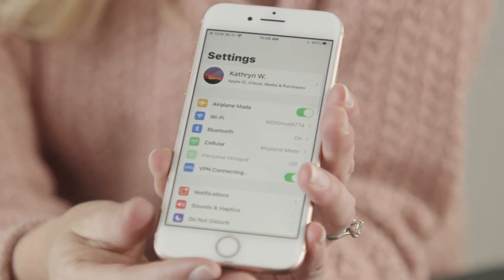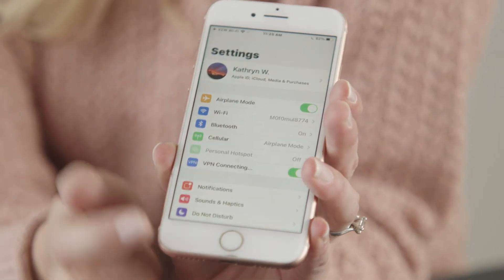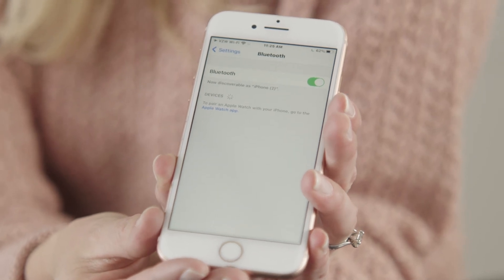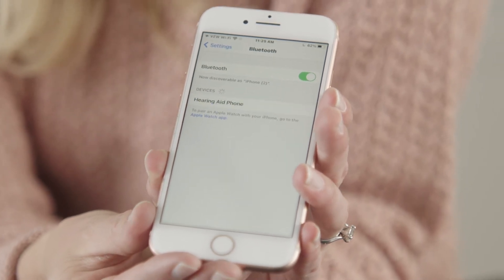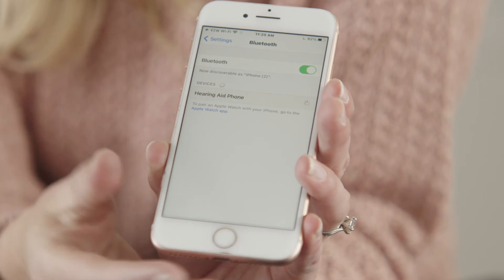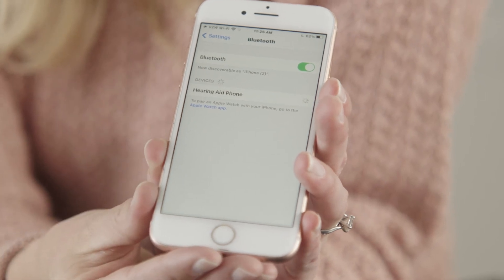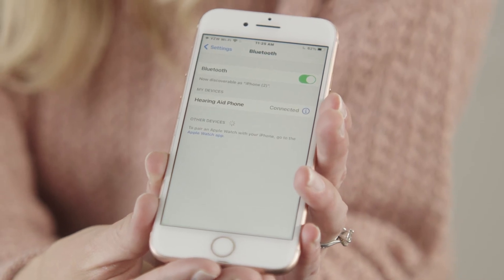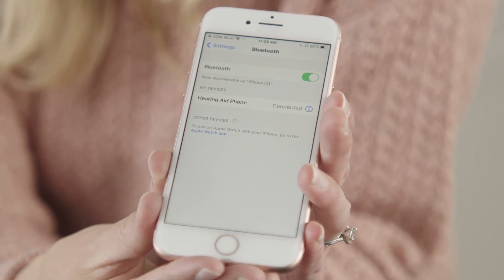Then, tap the settings icon on your phone, then tap Bluetooth. Tap the new device called Hearing Aid Phone. You'll see the word connected when it's successfully paired. Remember, you will only need to complete the initial pairing process once.